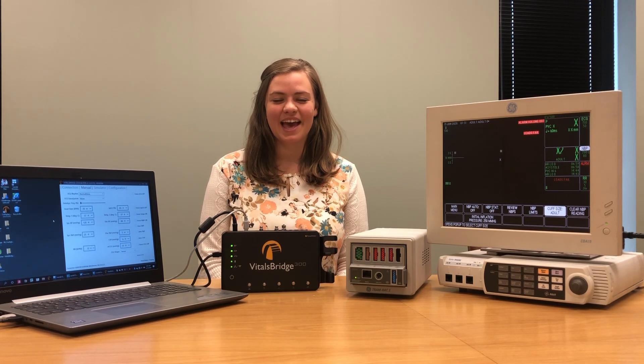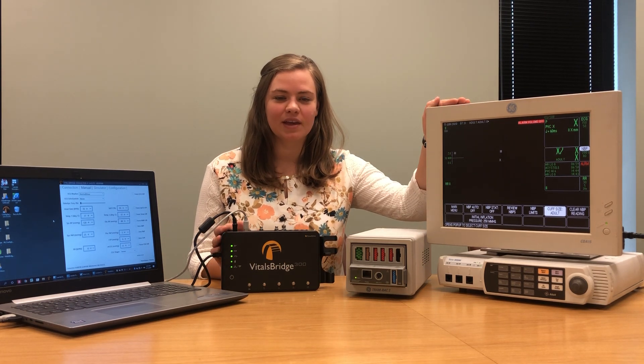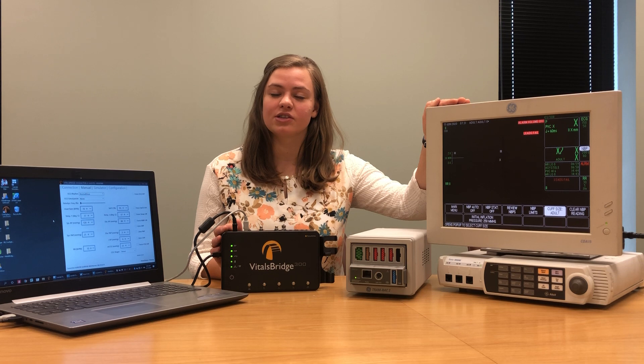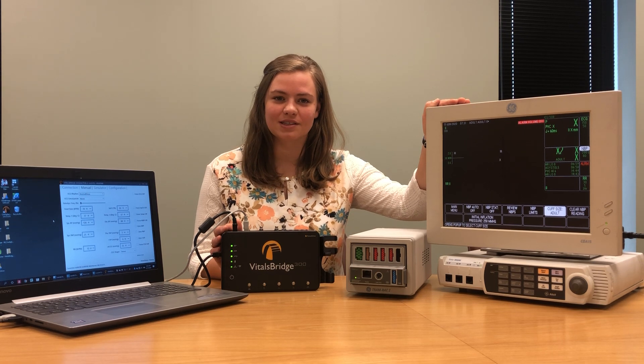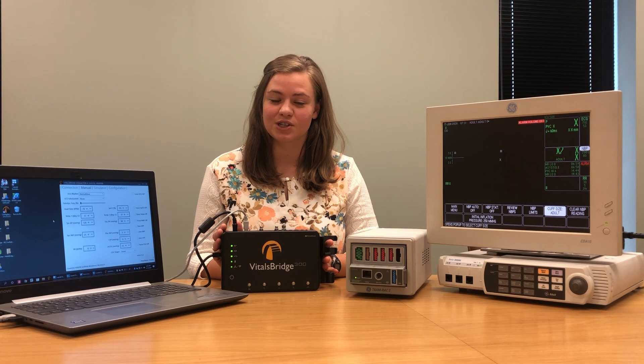Hi, my name is Haley and today I'm going to be showing you how to connect your VitalsBridge 300 to a GE patient monitor. This particular GE monitor does not support capnography measurements. To see how to connect the capnography function on your VitalsBridge 300 to a patient monitor, check out one of our other videos or download our instruction manual from VitalsBridge.com/downloads. This video can also be used to help you connect your VitalsBridge 200 to any GE patient monitor.